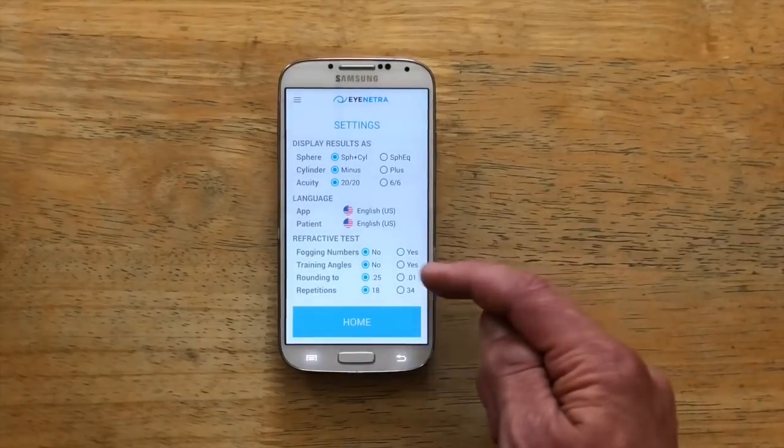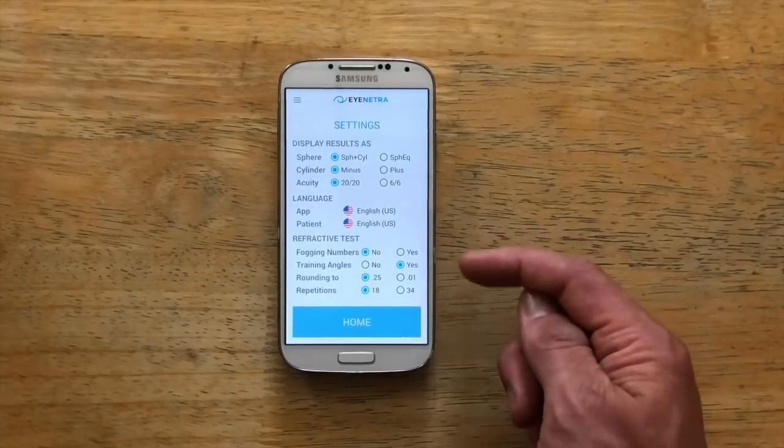Training angles: this feature adds an additional two repetitions to the beginning of the test which will not count towards the patient's final result. Training angles can be helpful as an additional training aid, especially if the patient requires additional instruction following the tutorial. When you activate this option, the two training angles are followed by a big blue play symbol in the center of the screen to indicate when training is over, and the patient must click the selection button one more time to begin the test.